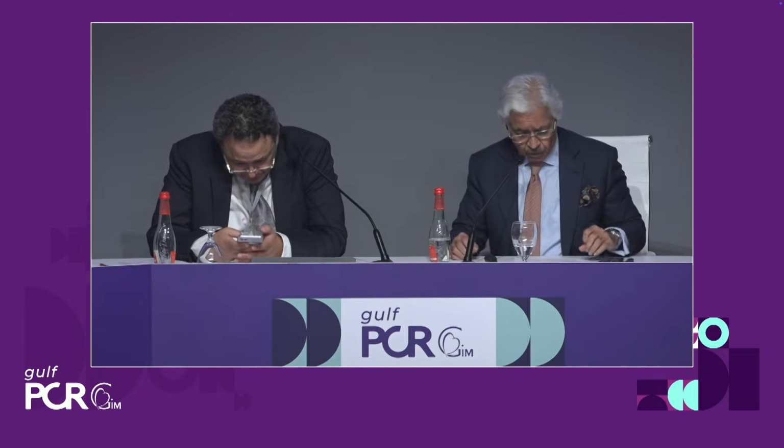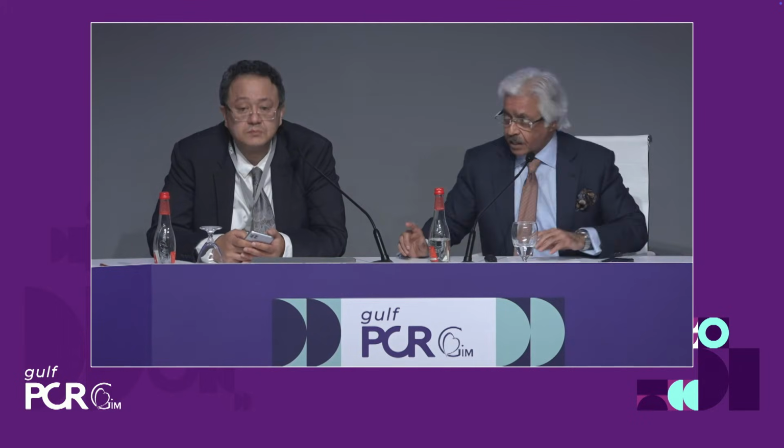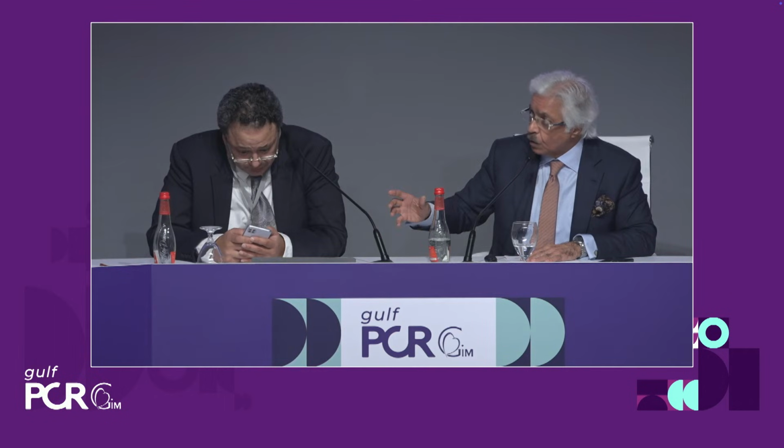So now, we should move ahead so that we can have more discussions towards the end. We've had input of all, unless I can have any last comments from a panelist to say, would they have done anything differently? Please go ahead.